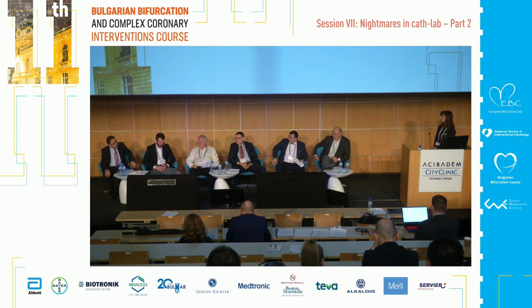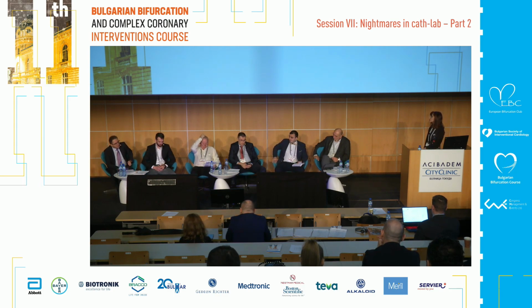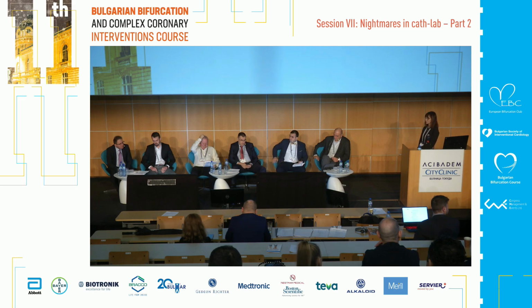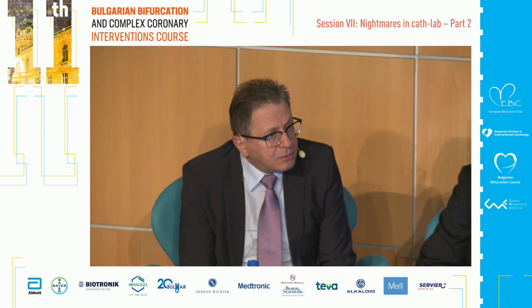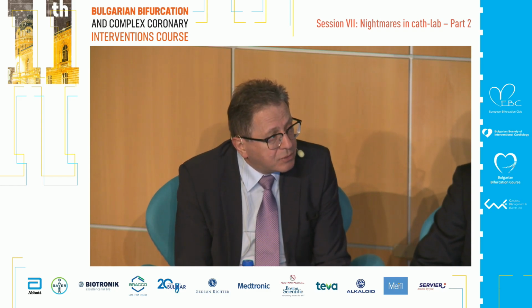Just one comment. We started to do more TAVI cases, but let's say by luck, the number of necessary coronary angiograms and PCI didn't increase. Why? Because now we know that coronary insufficiency in TAVI patients is not as big a deal as we thought 2-3 years ago.